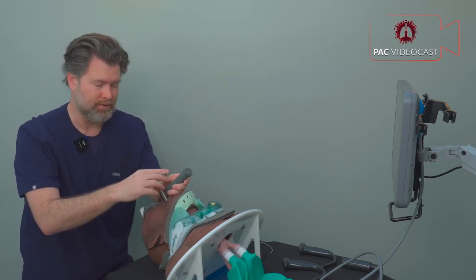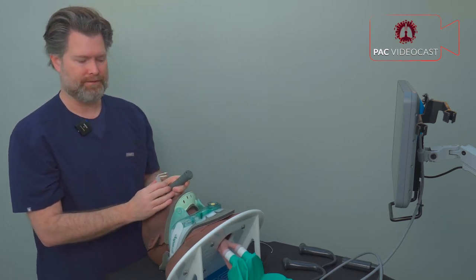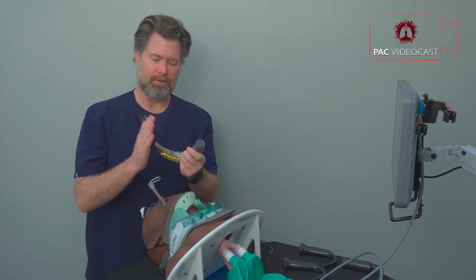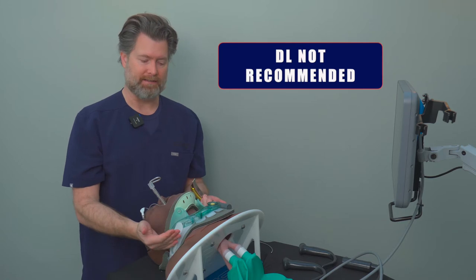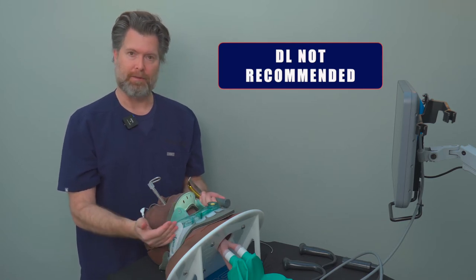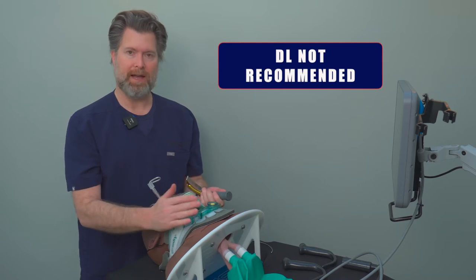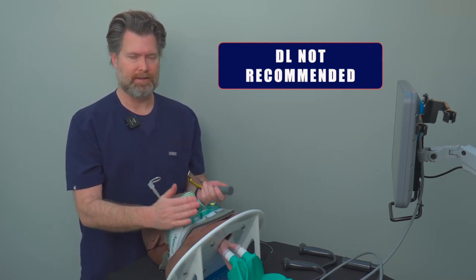I was able to place the tube but it required a lot of effort and a fair amount of force. If you're going to use a direct laryngoscope, you may want to consider using manual inline stabilization to give a little more accessibility and better views. It is possible to perform this with a cervical collar in place, but it's not ideal.